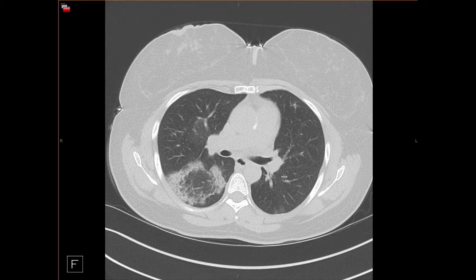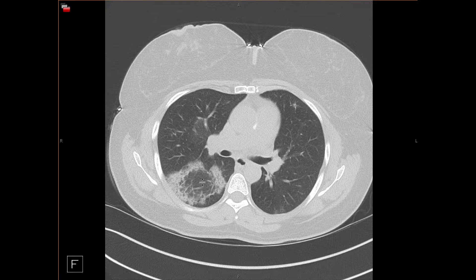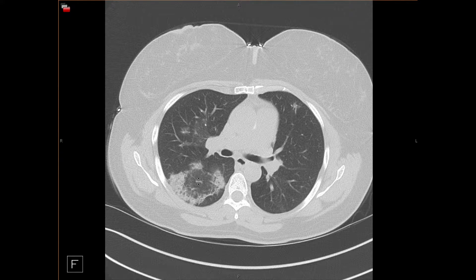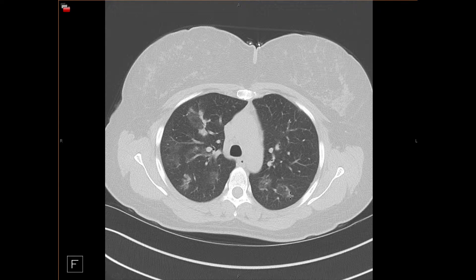The reverse halo sign is an area of airspace opacity that is denser peripherally than it is in the center. You may see peripheral ground glass with central normal lung, or peripheral consolidation with central normal lung or ground glass. It's important to distinguish this from cavitation, where the center has true air density — that's not the reverse halo sign. In this case, we see peripheral consolidation with central normal lung, as well as peripheral consolidation with central ground glass.